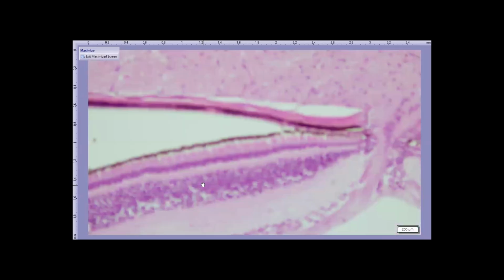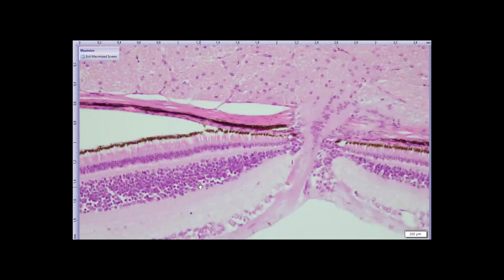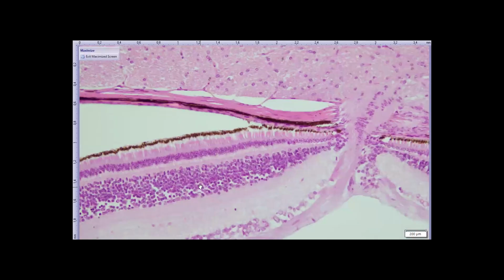And the other thing to notice, as was mentioned, here's the junction between the retina and the optic nerve. We can call it the optic nerve head, and it's extremely small. It's extremely narrow. This eye is sectioned in the vertical plane as we usually section mammalian eyes. We try and section them in the vertical plane, largely because we want to sample both the tapetal and the non-tapetal retina. Well, the ground squirrel doesn't have a tapetum. Instead, it has a retina like this.